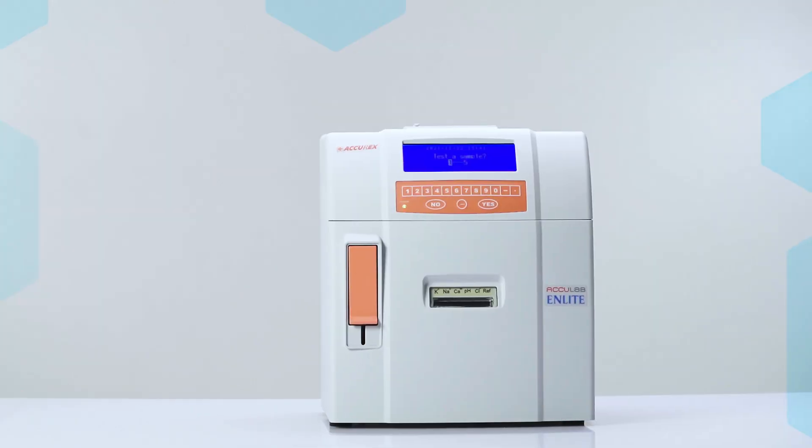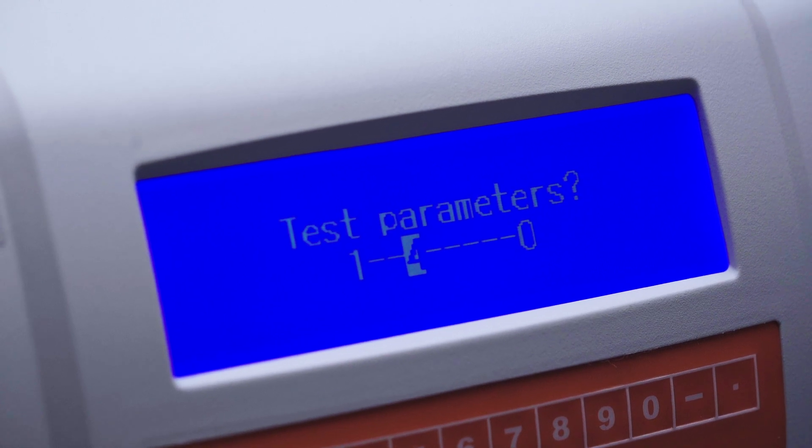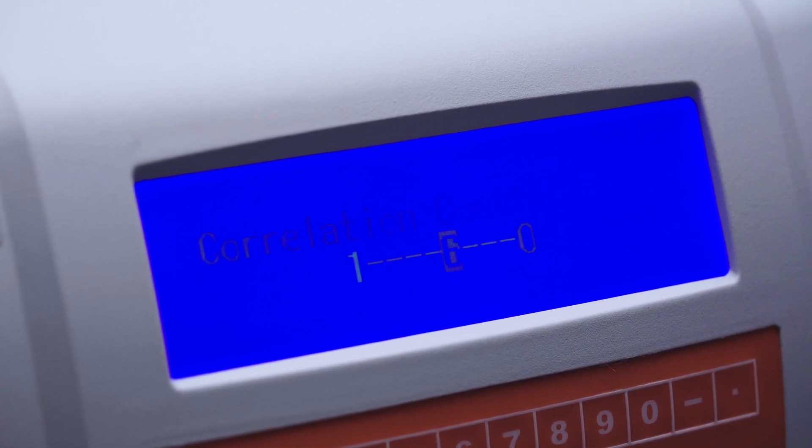This in turn provides excellent calcium results, making the N-Lite a must-have analyzer for presumptive testing for calcium.